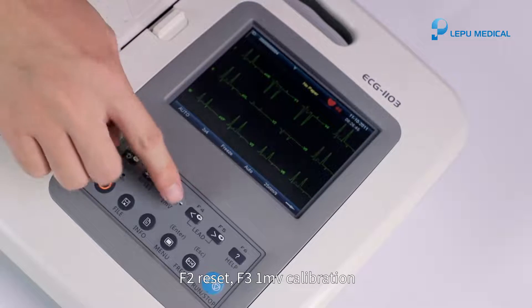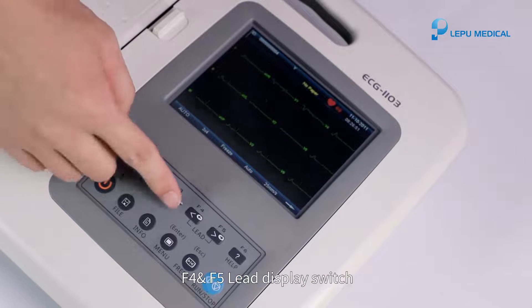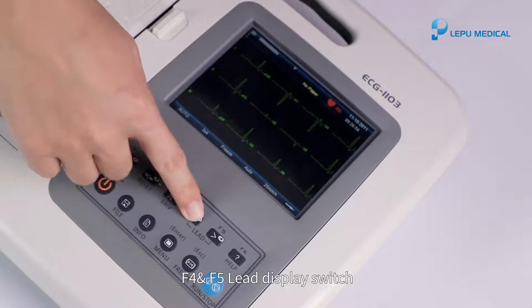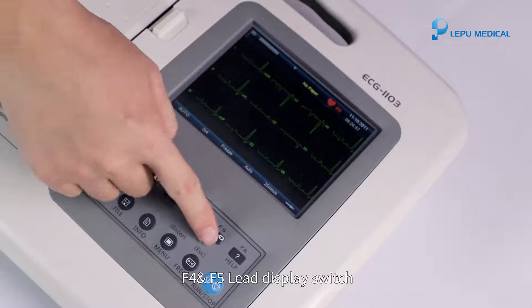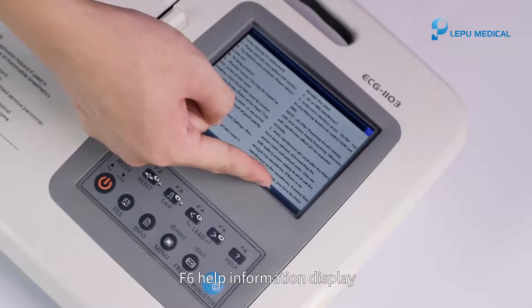F2: reset. F3: 1mV calibration. F4 and F5: lead display switch. F6: help information display.